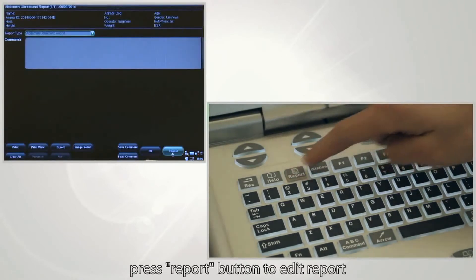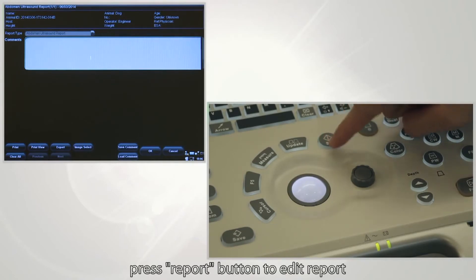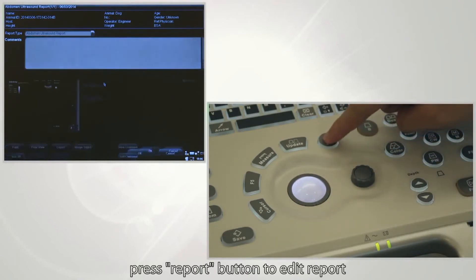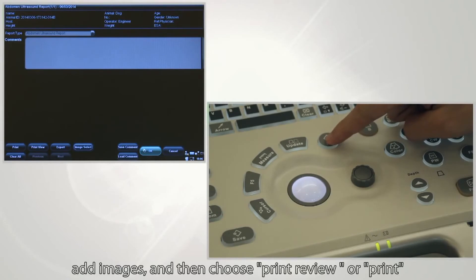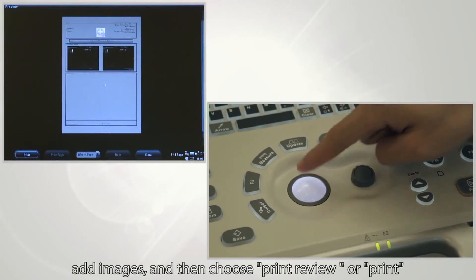Press the report button to edit the report. Add images, then choose to print or review.